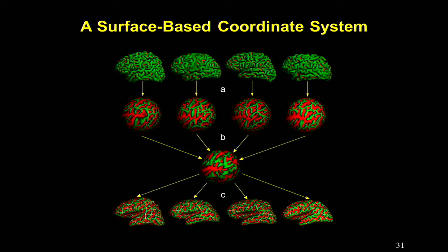In contrast, what we do is we use cortical geometry to drive registration. So we build models of the folding patterns. We represent them on the unit sphere. So here, red are things that were geometrically folded in. This is the Sylvian fissure. Here's the central sulcus. And the game we play is to take each one of these red-green patterns, extract statistics across subjects. So this is 4 subjects, represent them in some coordinate system, and then move these red-green patterns around so that they're in alignment.